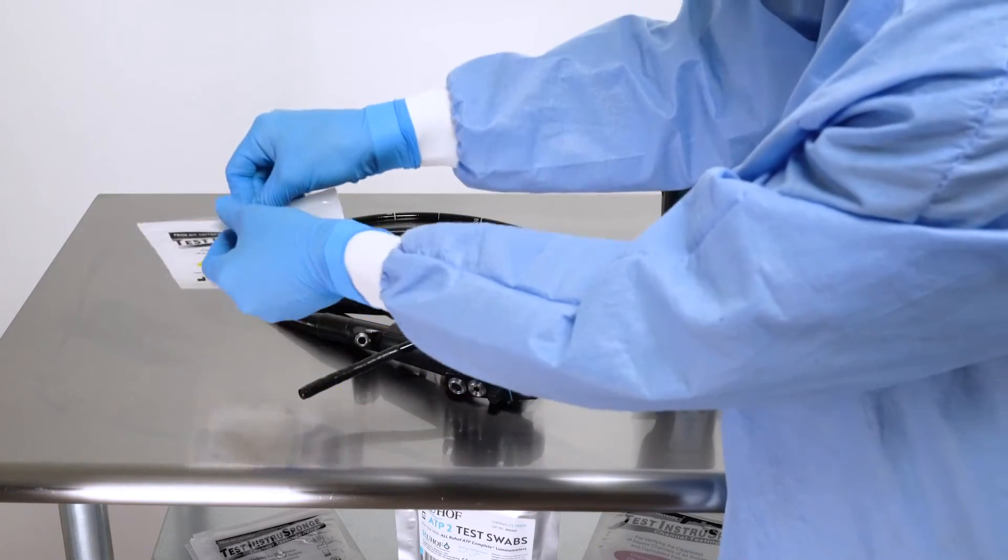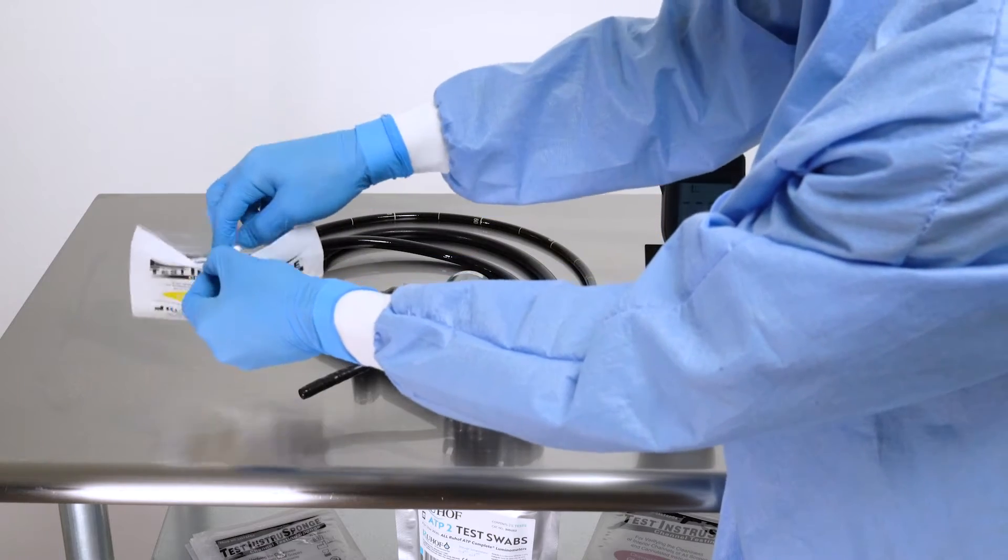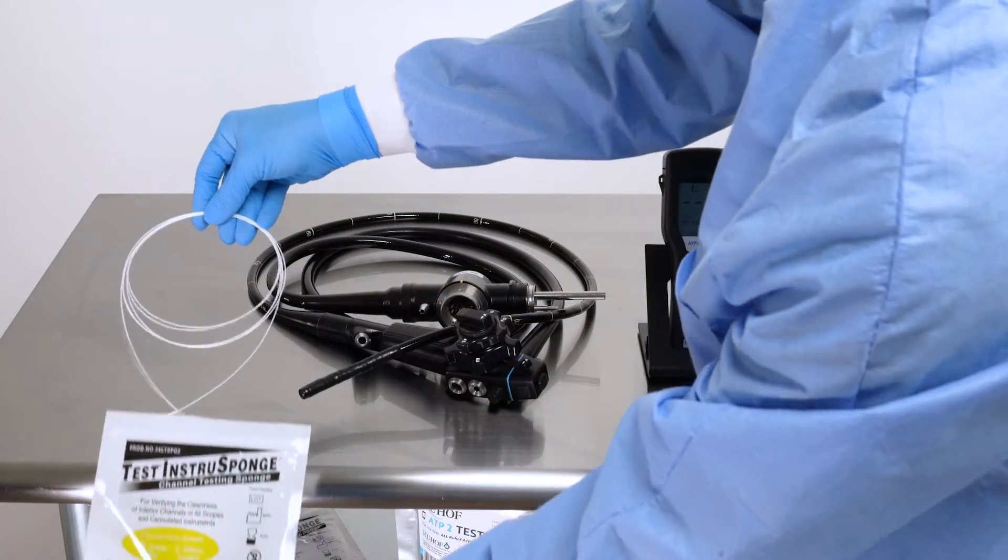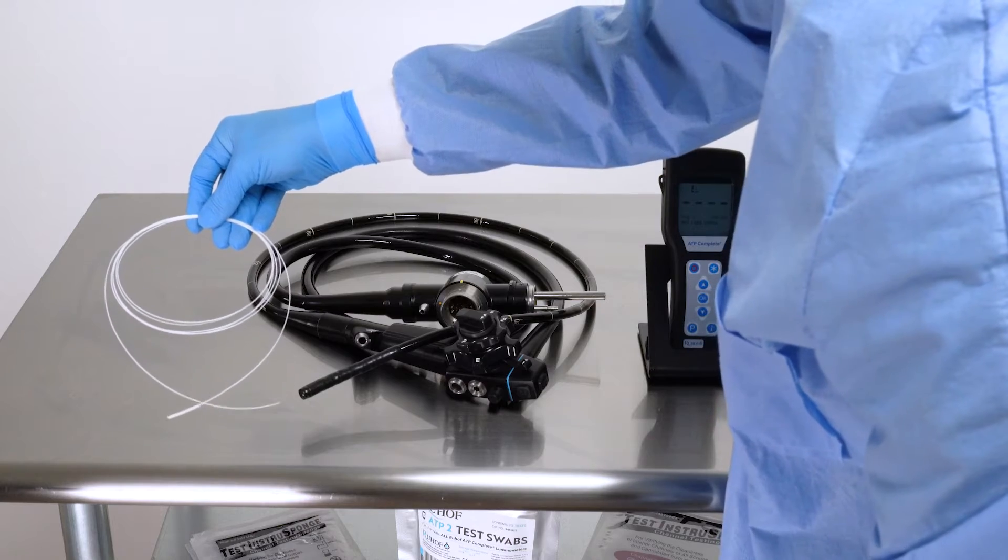Select the appropriately sized Ruhoff test Instra sponge based on the size of the inside cannula of the scope you are testing, and remove it from the packaging.